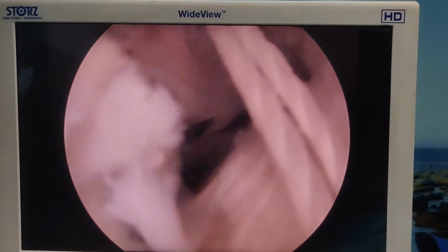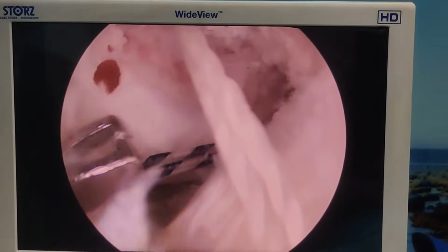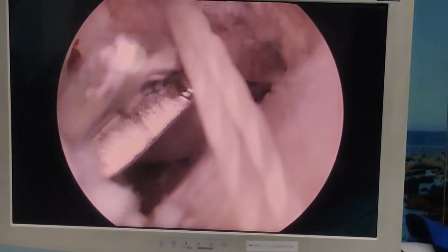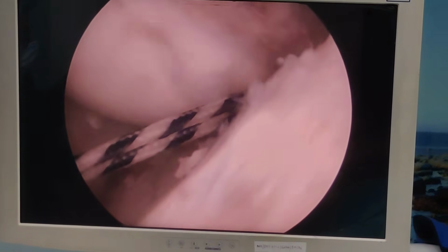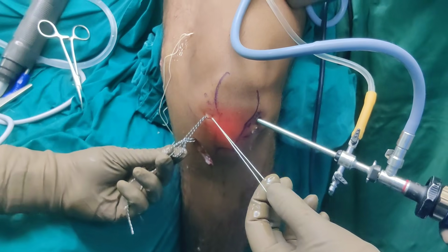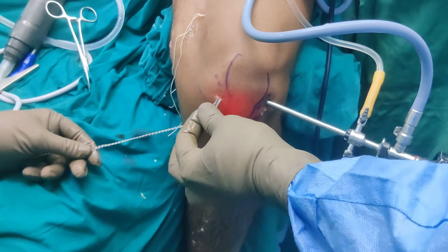The black and white suture is the suture that went through our tibial tunnel, and this white suture has gone through the femoral tunnel. So now my suture retriever has gone from the anteromedial portal, and I am trying to bring this out into this anteromedial portal. So Prashant, if you can show it here. So now both the sutures are in the anteromedial portal. This is the tibial one, this is the femoral one.